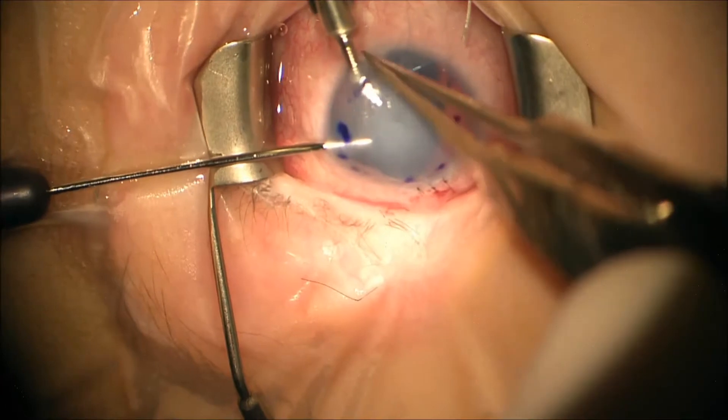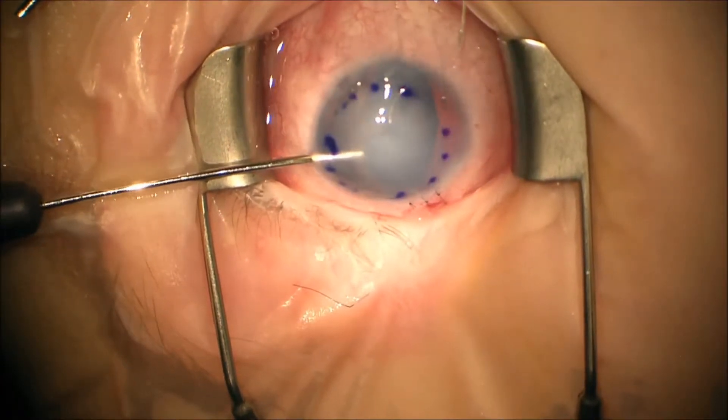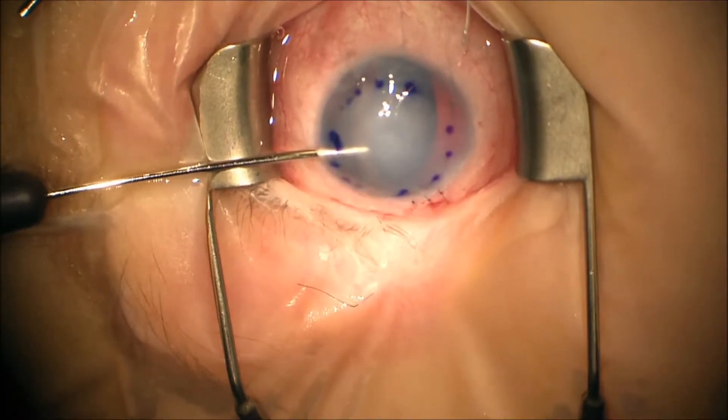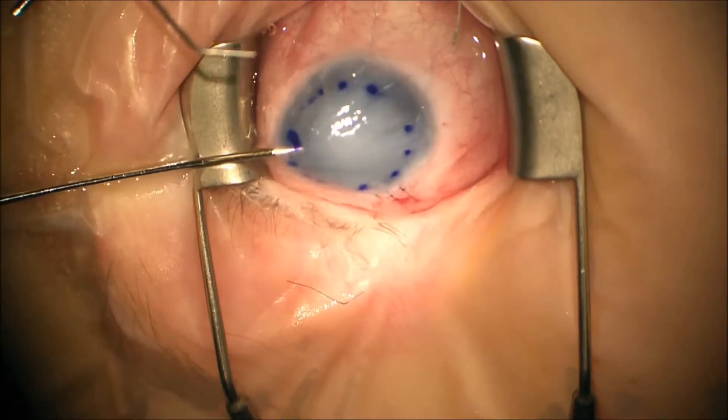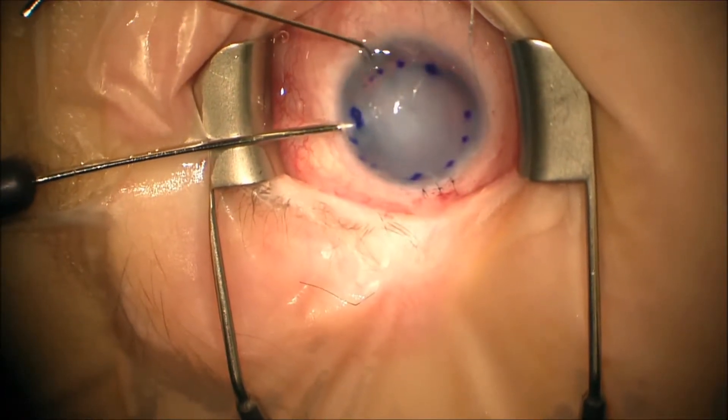It's very hard to have fluid currents in the eye, especially since there's no formed anterior chamber. Next we inject SF6 into the eye to help provide some tamponade to hold the graft into position.